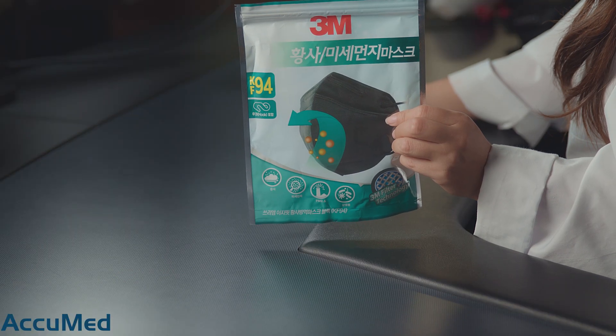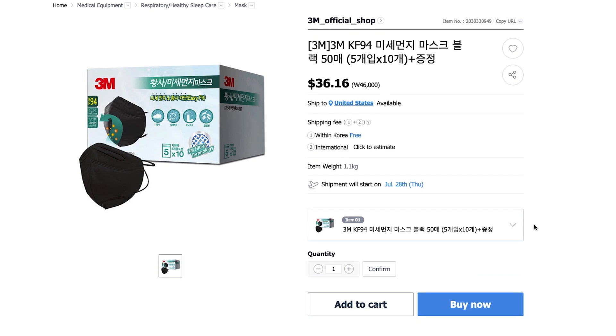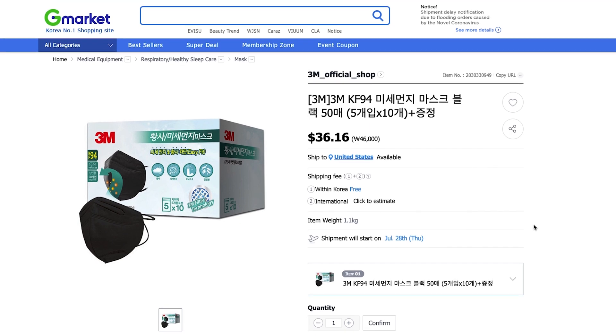Hello everyone and welcome back to the Acumen YouTube channel. Today we're going to be reviewing a mask that was sent to us — this is the 3M KF94. The viewer sent us the link on where they purchased these; they were purchased on G Market and come in a box of 50 for $36.25.